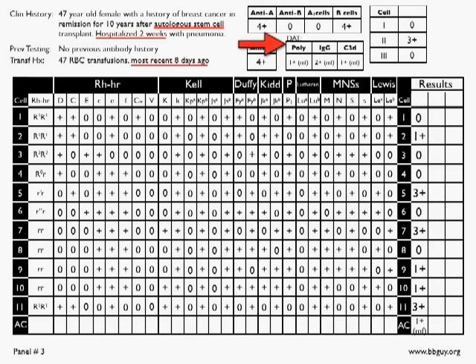If you look at the antibody screen, the antibody screen shows only reaction in cell 2. It's a fairly strong reaction in cell 2. More on that in just a second. I hope that when you took a look at the results, you thought first, well, what's the technology that's being used here? As we talked about in the last podcast, if you see a single column like this, then you are almost always talking about automated technology such as gel or solid phase, in particular if it's unlabeled.